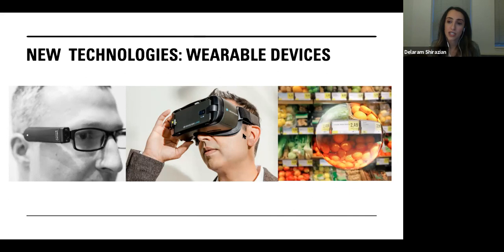Next is this Iris Vision device. This is a head-mounted wearable augmented reality device. So it utilizes the Samsung phone device to magnify things and also overlays. So one thing it has here is this bubble on this picture where it will magnify whatever is in that bubble. And it also has a reading view. It has audio output as well. But you cannot walk around with this device. Again, your side vision is going to be severely impacted because you're wearing a head-mounted wearable device. So this is also utilized when you are stationary.